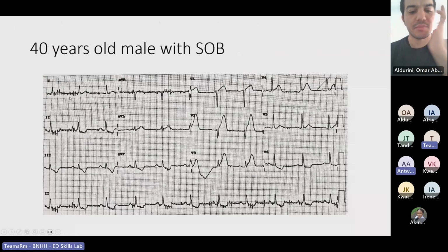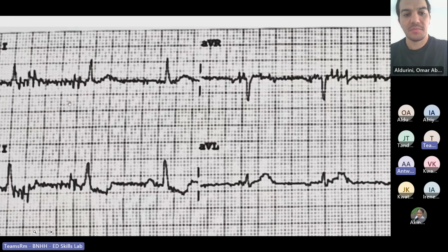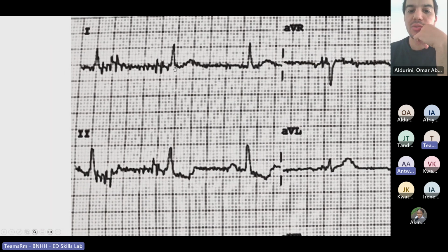The one I'm looking at is... So if you tell me there is an elevation or depression, I will ask you about the J point, the junction point. Is the junction point here? Okay. If we agree to that one, I'm looking at that line. Is it elevated or depressed? Where you just put your pointer, that one. Yes, that's the J point.